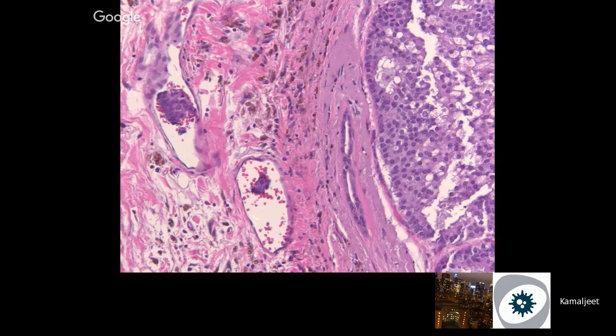Another artifact is that you can actually see the displaced tumor cells in the vessels. So they will be degenerative looking. They might be associated with hemosiderin, and they will be near the biopsy tract.